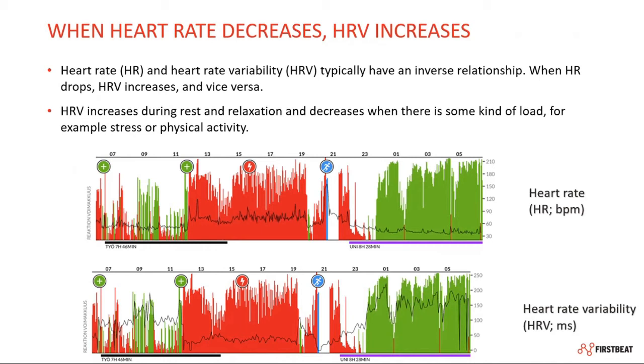And then based on the context and the additional information that we can get from the heart rate variability data, for example, the movement data and respiration, it helps us differentiate what's a mentally stressful situation, indicated by the red color here in the afternoon, versus a physically stressful situation where the person is clearly moving and things like respiration and oxygen uptake are increasing as well.